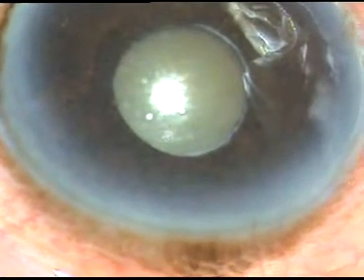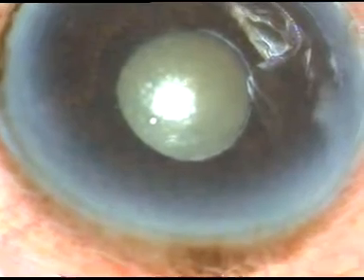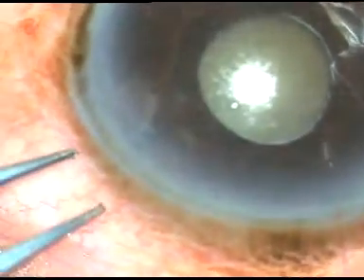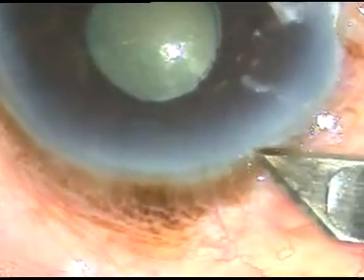Dear colleagues, this eye of an 82-year-old gentleman is having grade 3 cataract with a three-and-a-half millimeter pupil, and there is a fibrotic band at the pupillary border from 6 o'clock to 12 o'clock. How to do this case?